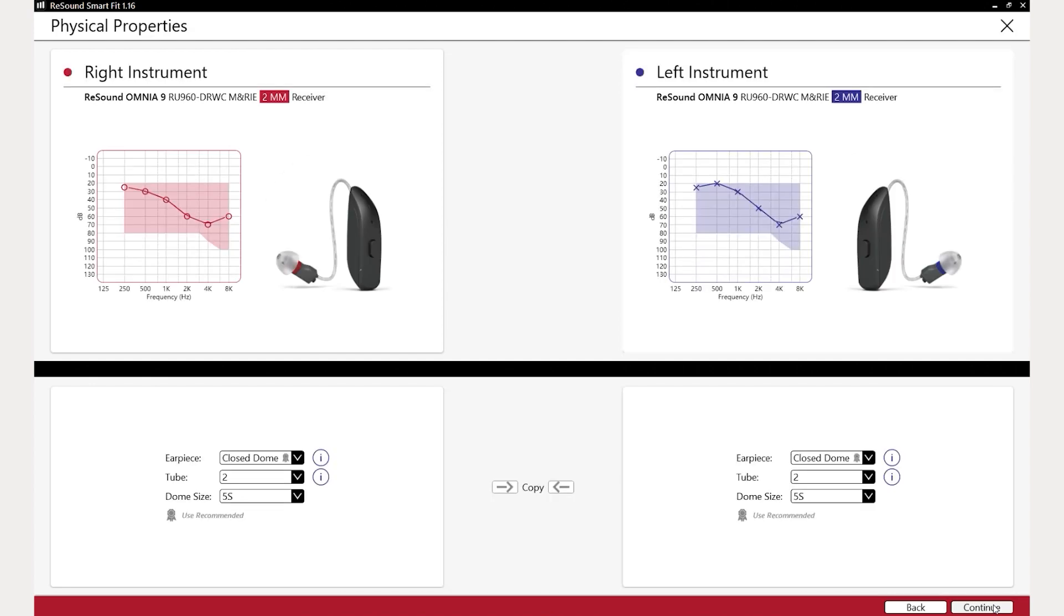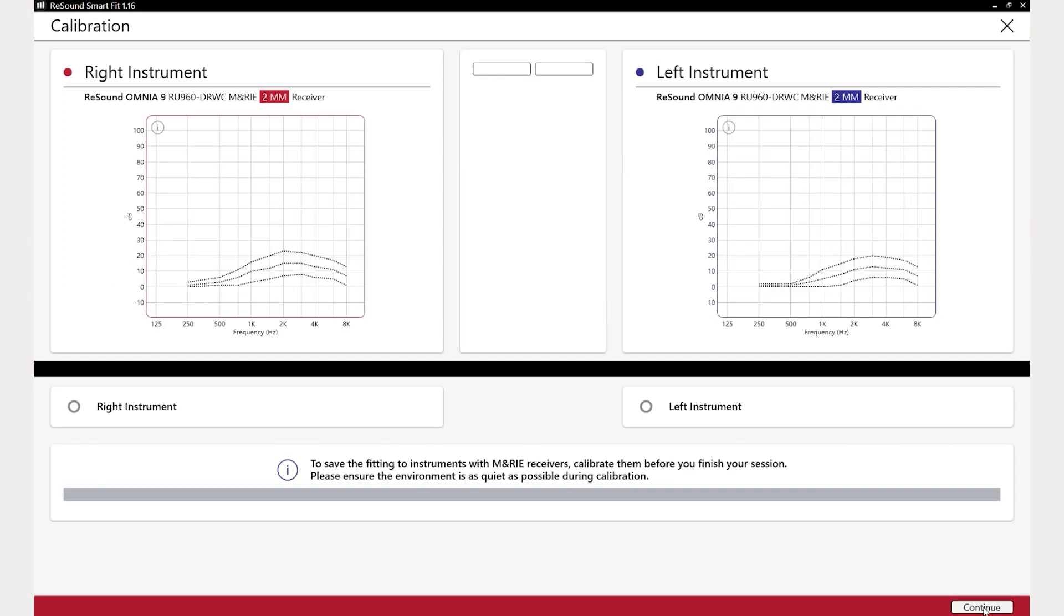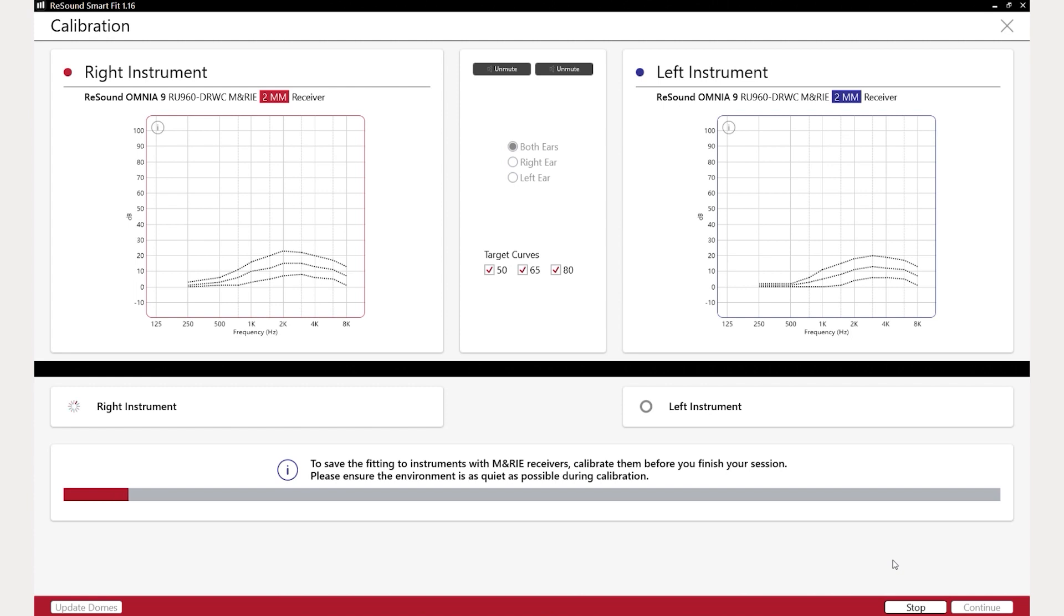Choose the correct dome and dome size. Calibration is recommended for all fittings. Ensure the sound environment is quiet during calibration.